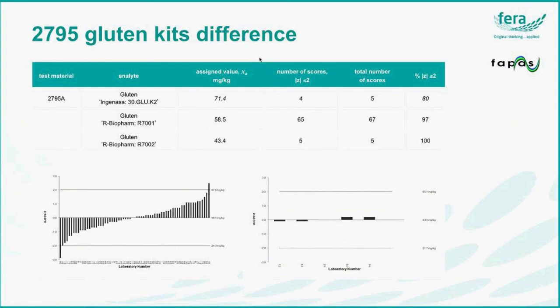Allergens is well documented in the scientific press. You can see the effects on proficiency testing in that we need to separate allergens results according to the ELISA kit that labs use.